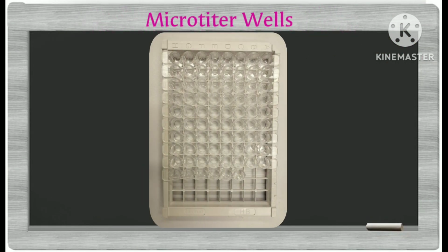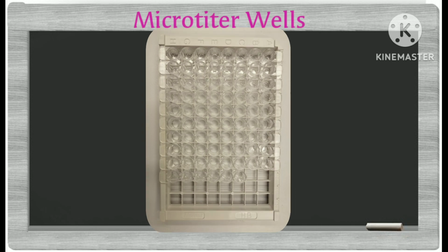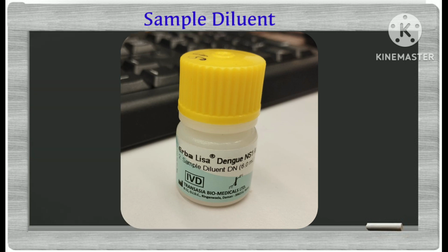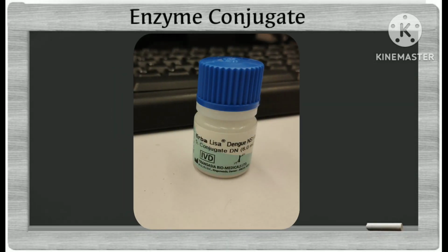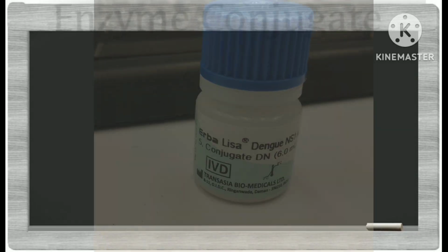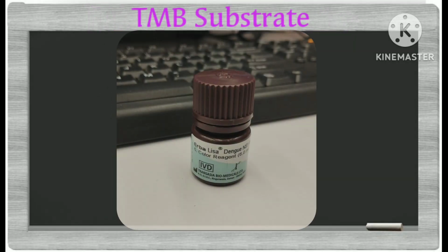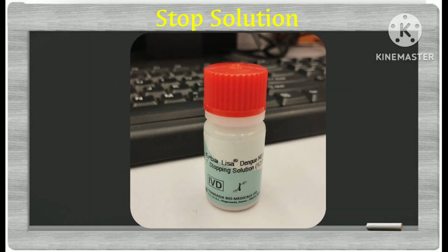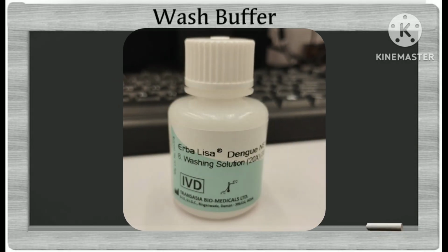ELISA is an important topic of immunology for DMLT and BMLT students because dengue, thyroid tests, vitamins, and other hormonal tests are done by this technique in the laboratories. Nowadays, ELISA is replaced by the CLIA method, chemiluminescence immunoassay method. But ELISA is the basic important topic of theory and practical for MLT students and professionals.